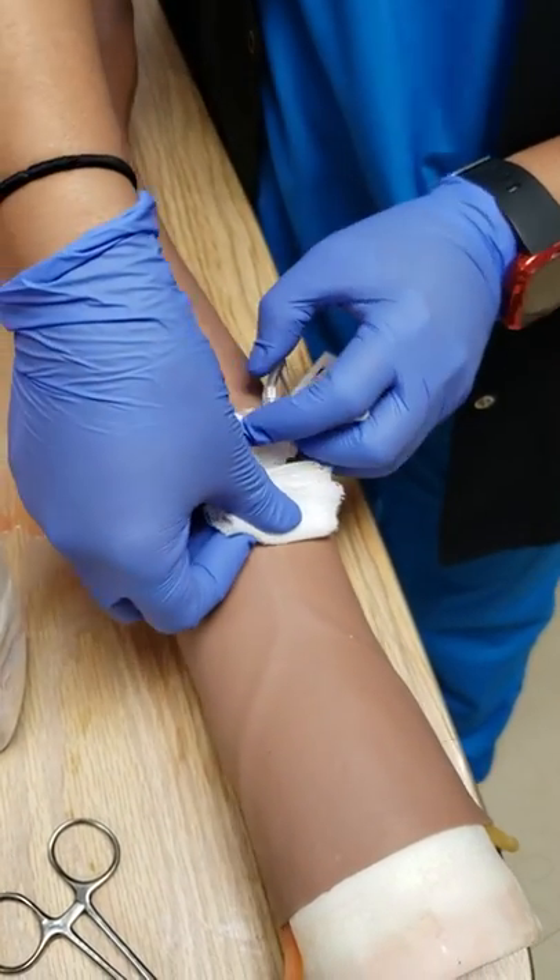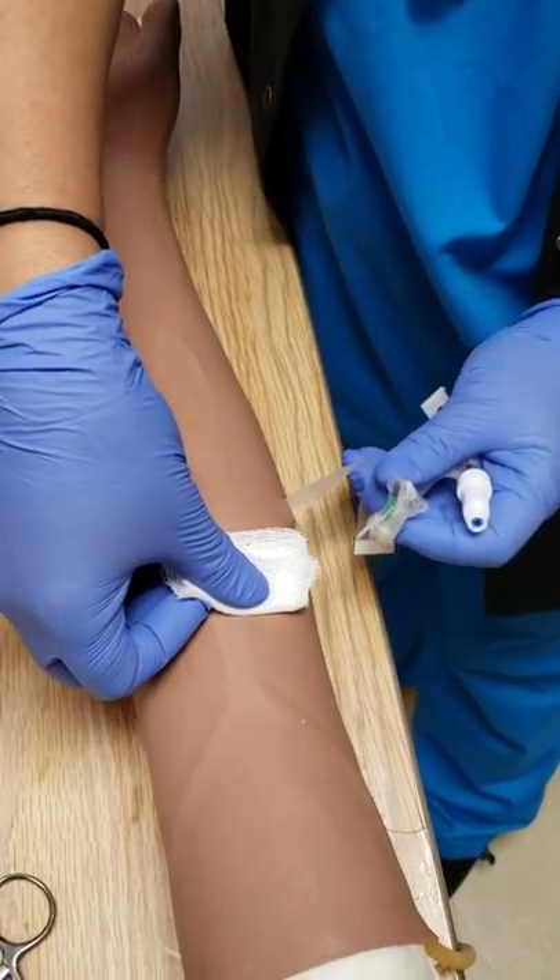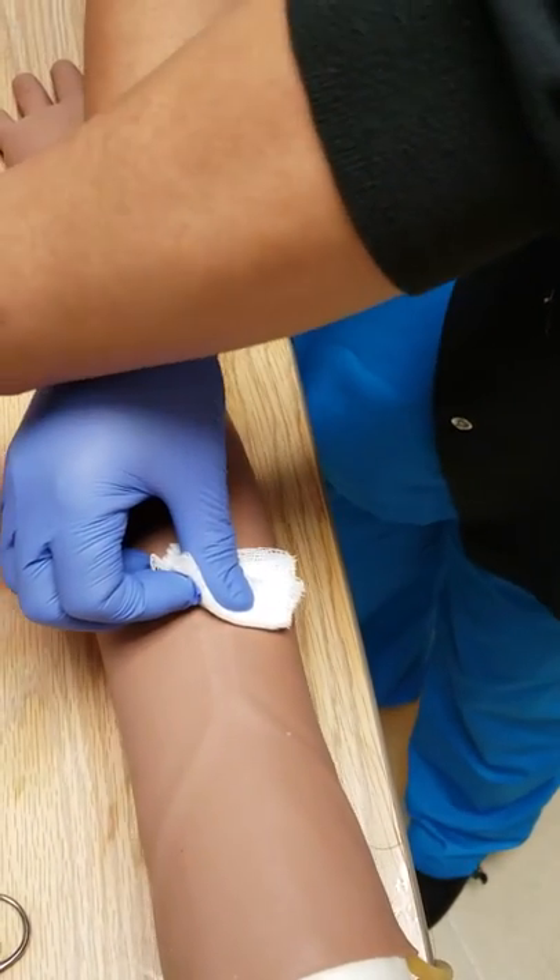Apply pressure on there and pull the catheter out. You should have the whole thing out. Put that aside.